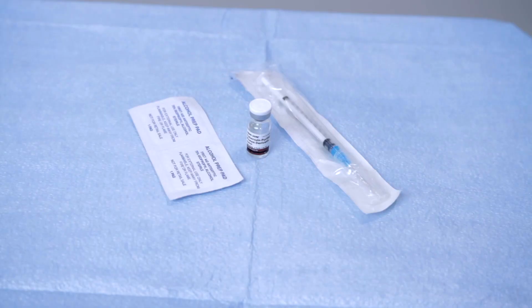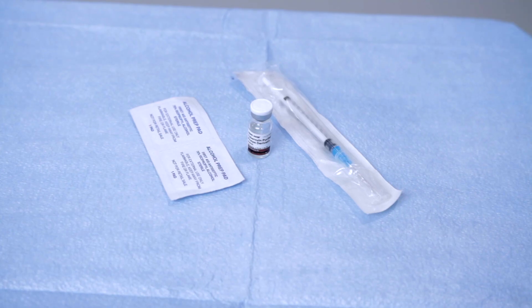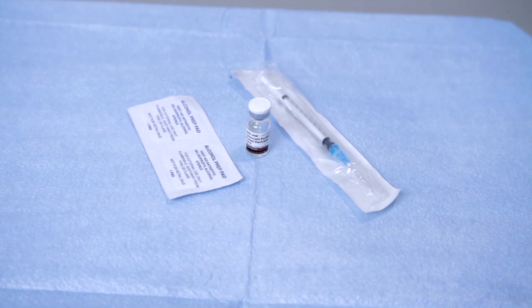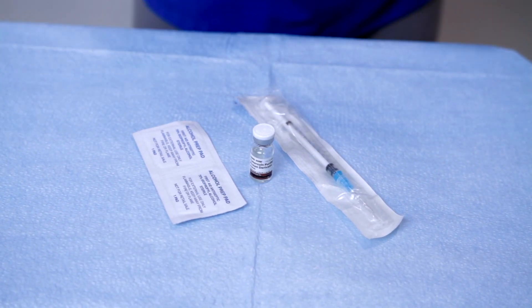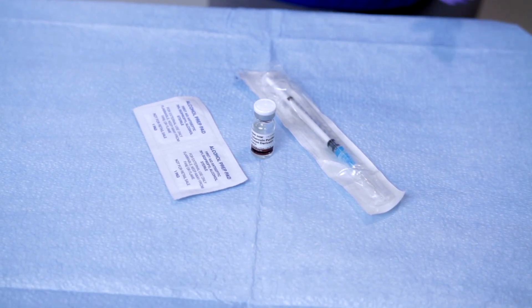Step one — first things first, always set yourself up for success with your supplies ready to go. Make sure you have your tuberculin syringe, one mil, 26 to 27 gauge needle, alcohol swabs, a vial of PPD solution, gloves, sharps container, and dry gauze.